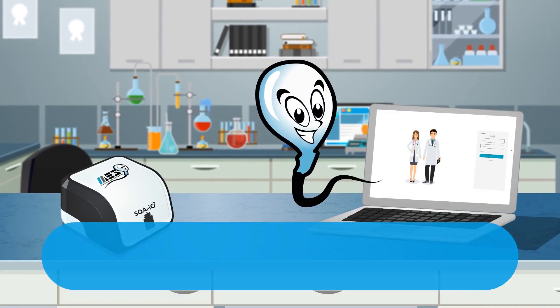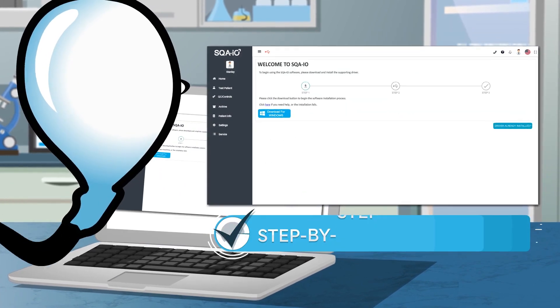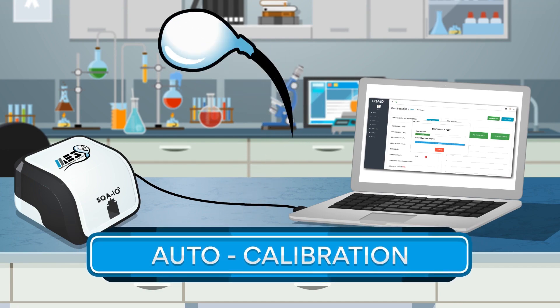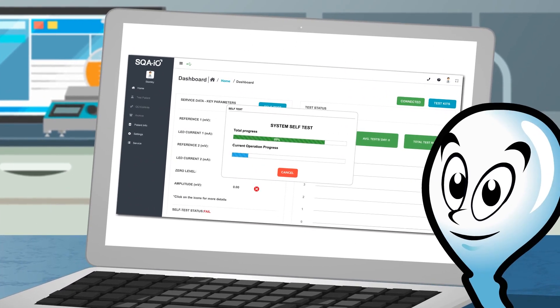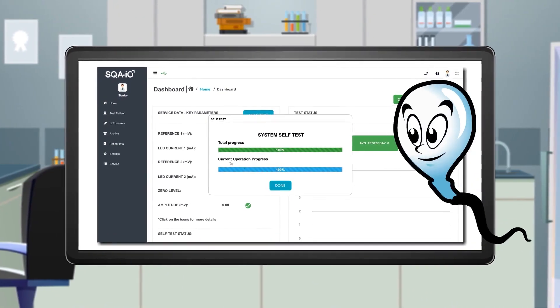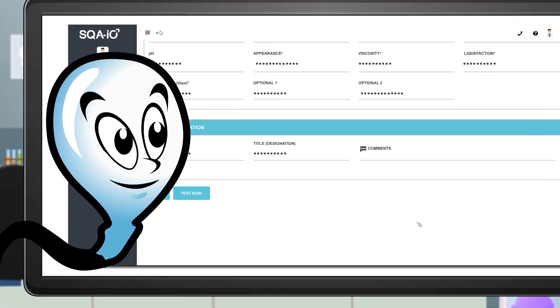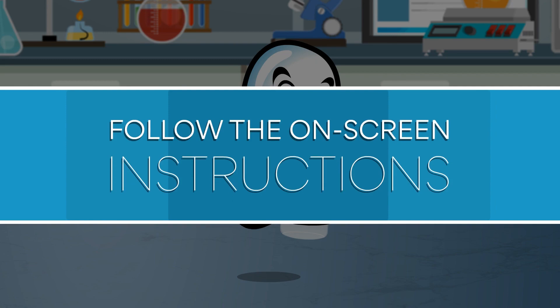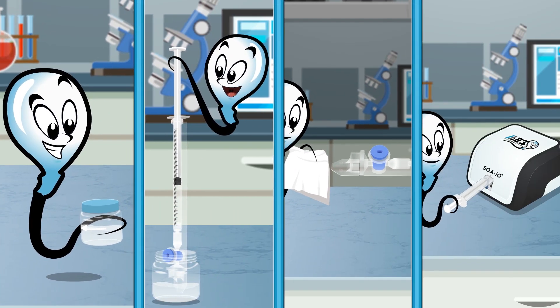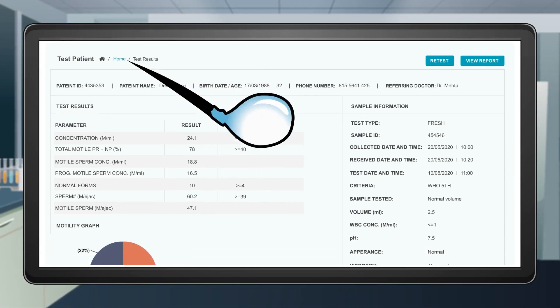After purchasing your system, visit sqaio.com to create an account. Then follow the step-by-step instructions to connect your device. The system will perform an auto-calibration and self-test each day of use — no calibration is required by the user. To start testing, choose Test Patient from the main menu and enter your sample information. Click Test Now, then follow the on-screen instructions to mix the sample and load the testing capillary. Insert the sample when prompted to begin the analysis.